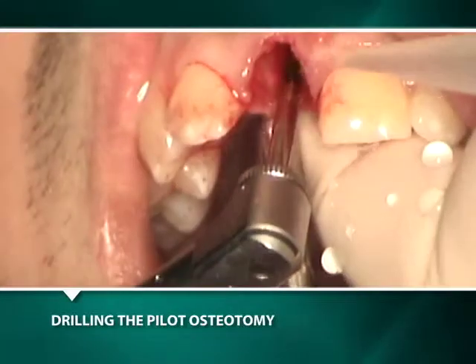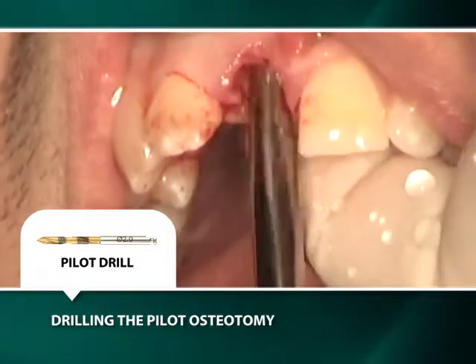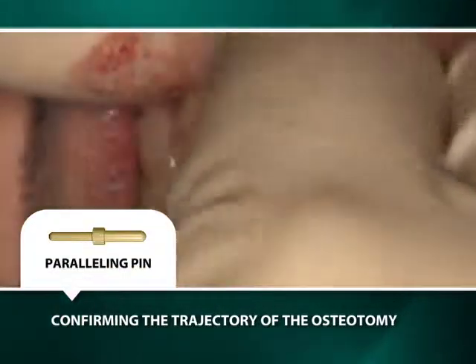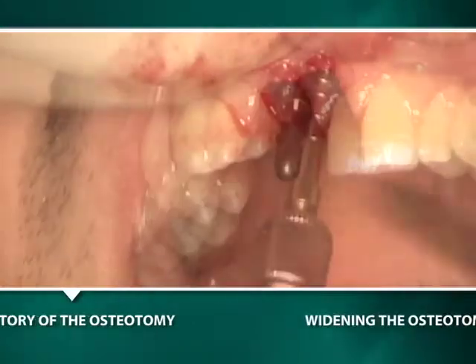The drill is used with a pumping action to a depth of 11 millimeters, as measured from the interproximal crestal bone. A gold-colored parallel pin is placed into the pilot osteotomy to confirm the appropriateness of the osteotomy's position and trajectory.